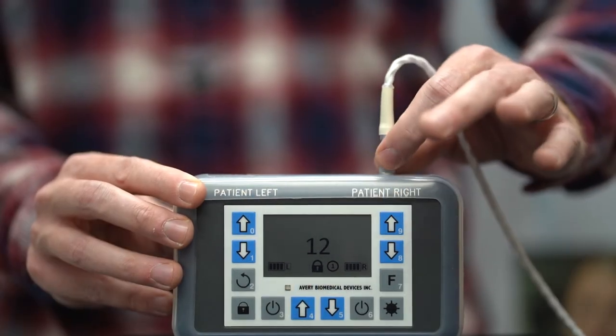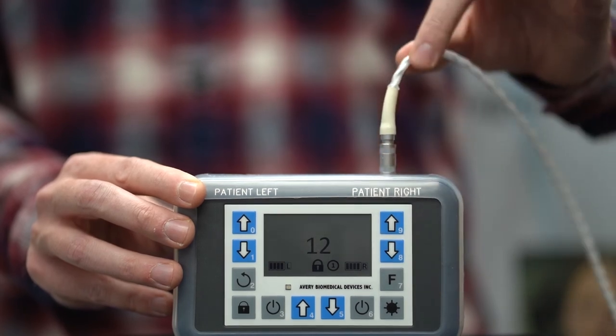Do not pull on the wire or its rubber covering, and do not twist it or force it to disconnect.